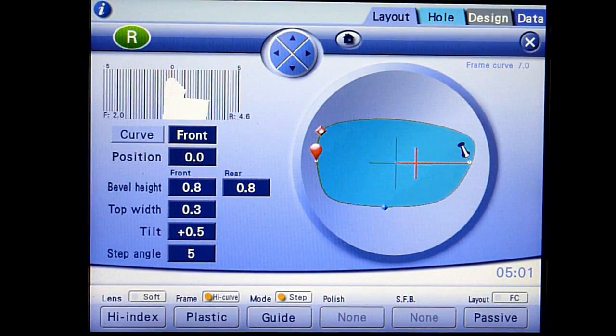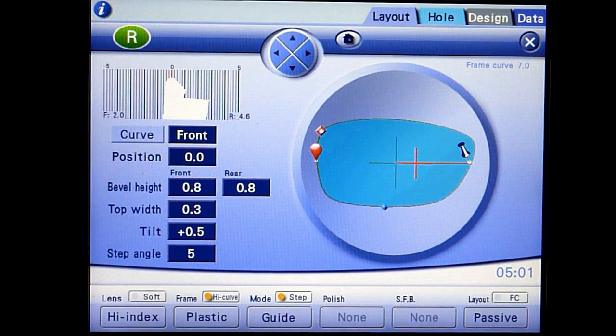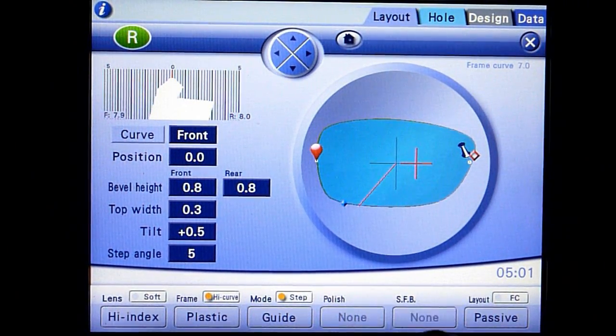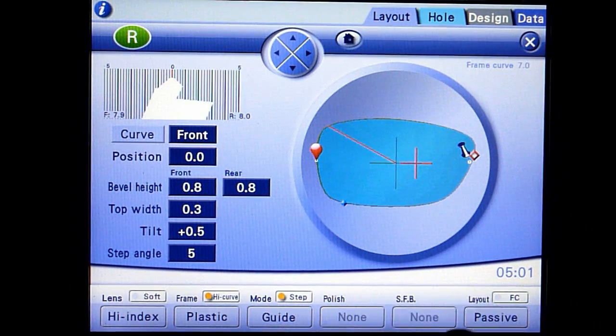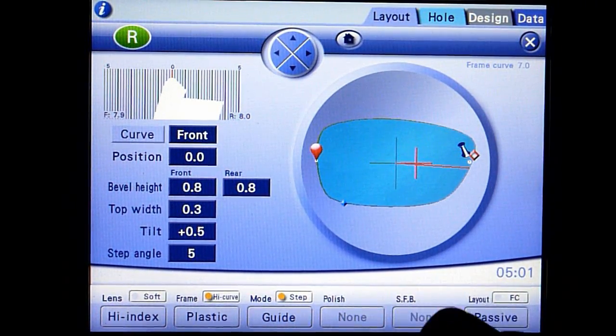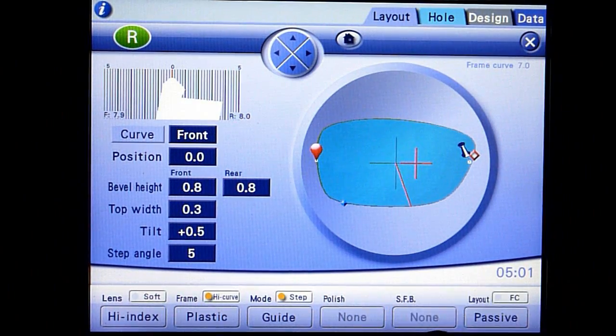After the roughing cycle, the edger will pause and the bevel simulation screen will appear showing the profile of the lens. Turn the jog dial to view the bevel placement and adjust the curve, tilt, or position values to get the desired result.